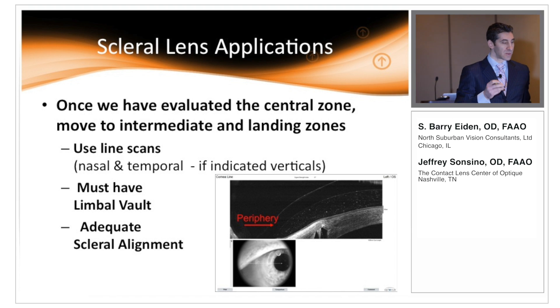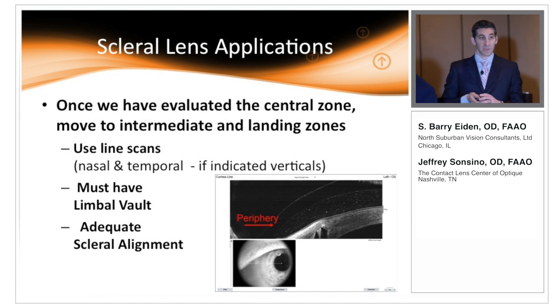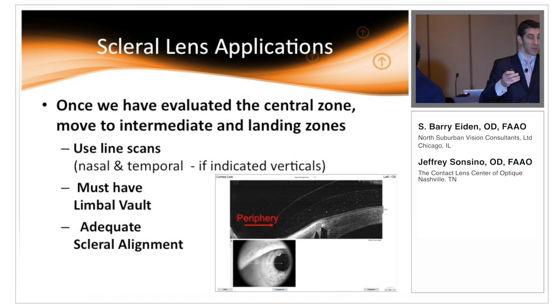Once we do that cross scan and evaluate the central part of the lens, we focus on where that lens is going to land on the cornea or sclera. In the case of a hybrid lens, it's going to land somewhere on the peripheral cornea and we want to know how it's landing, making sure it's not bearing. For a scleral, we make sure what it's doing way at the periphery — we have the patient look straight ahead and move the machine over to take a line scan through the area of landing.